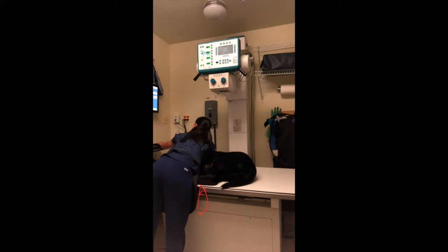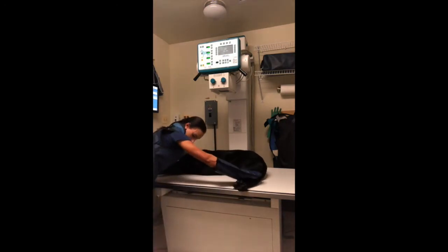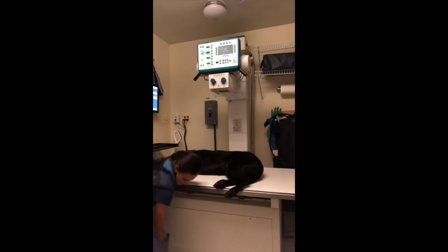The formula for gastric emptying with the use of BIPS includes: first, you count the number of BIPS that the animal has left in the stomach. Secondly, you want to calculate as follows: the number of BIPS that the animal has left in the stomach divided by the total number of BIPS seen on the image, and multiply that by 100. Then you will get the percentage of BIPS that the animal has left in the stomach.